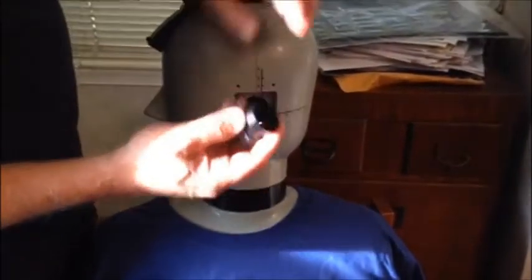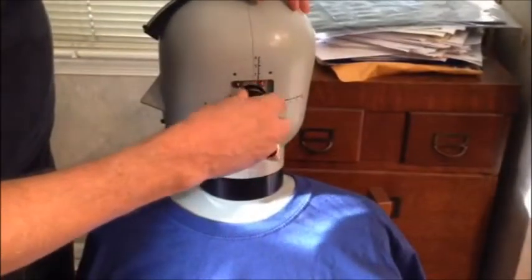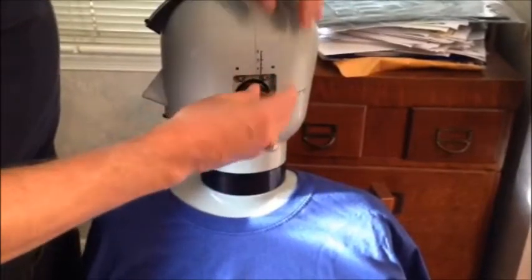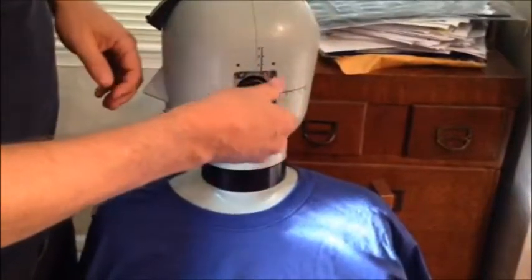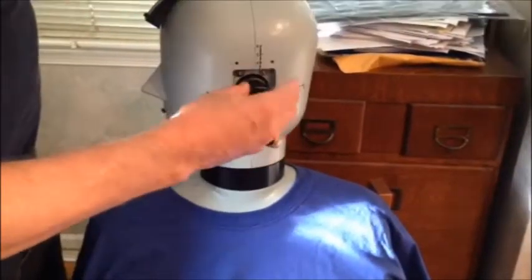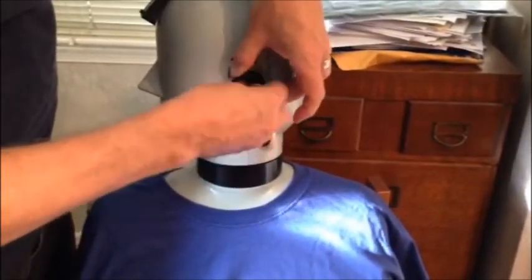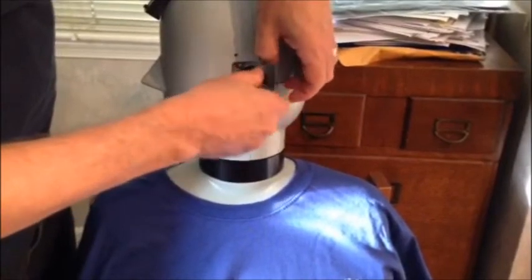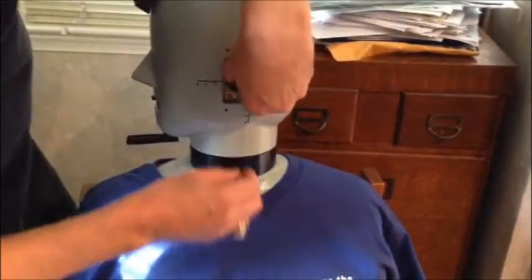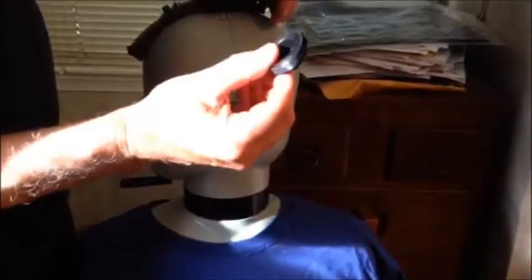The tool has two small tabs and they slip into holes on the retaining ring. I can now unscrew the retaining ring. You can see the retaining ring here.